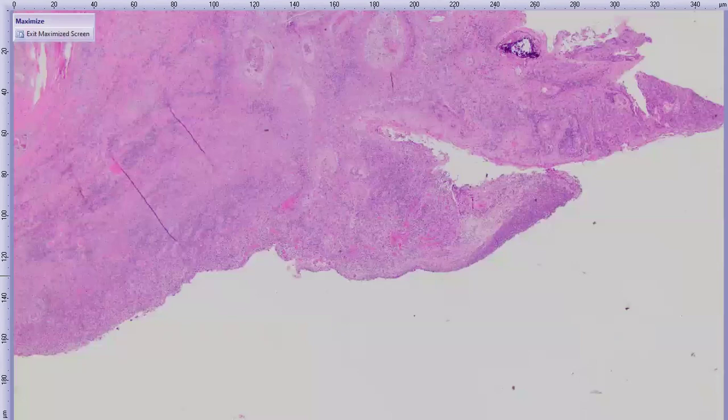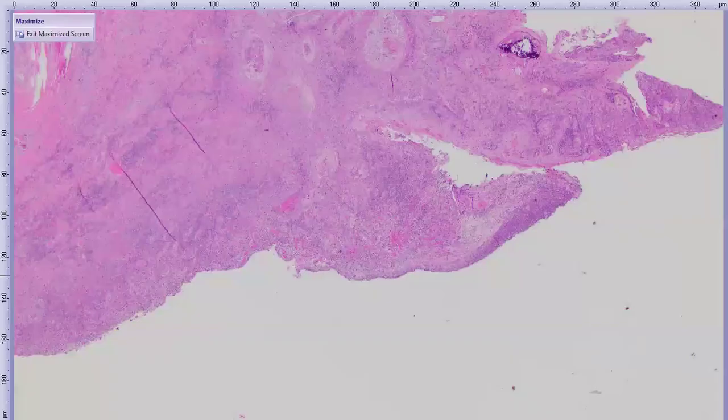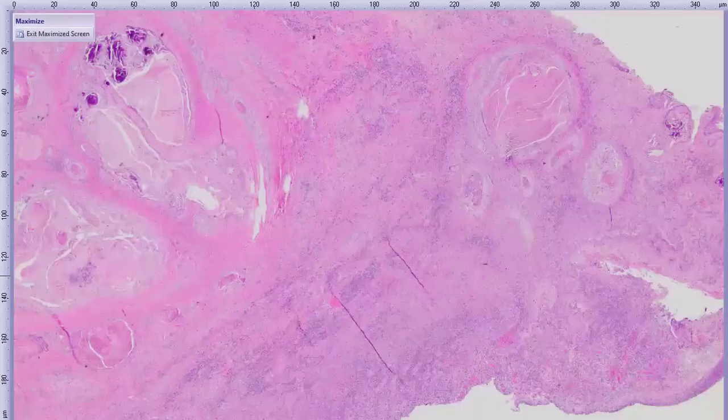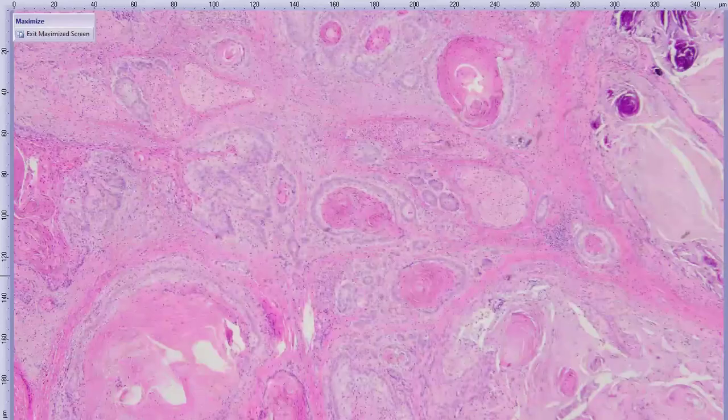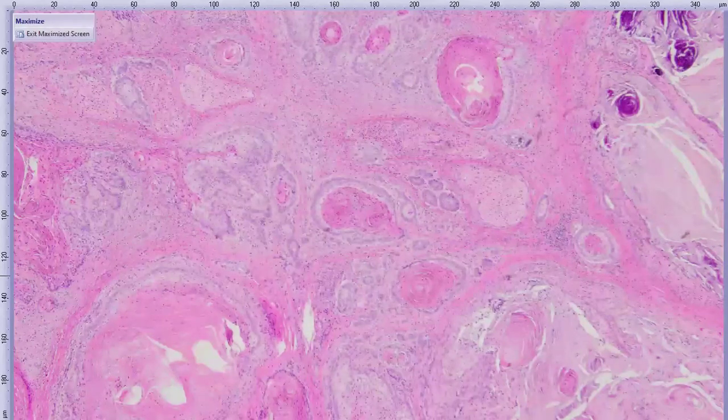So this is a Belgian horse, and we have a history of presumed bilateral squamous cell carcinoma. Here, let me drop on something more interesting before we start talking about this. All right. So the left, let's see. Okay, the left third eyelid also had squamous cell carcinoma. This eye has this really invasive squamous cell carcinoma that involves the ocular surface.